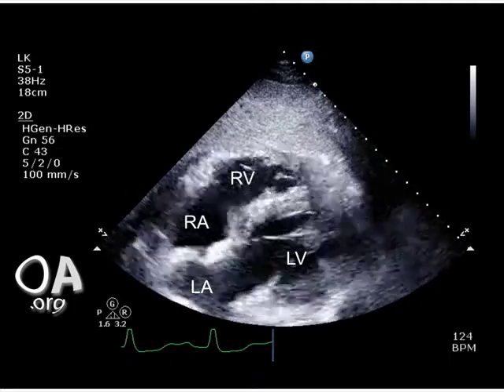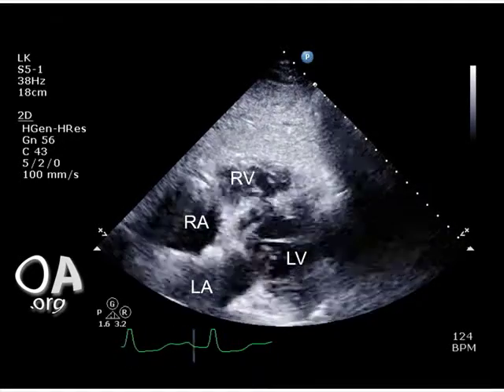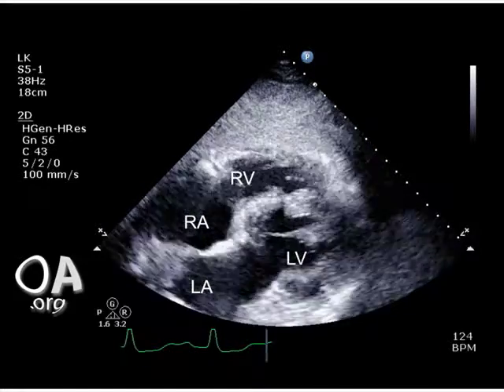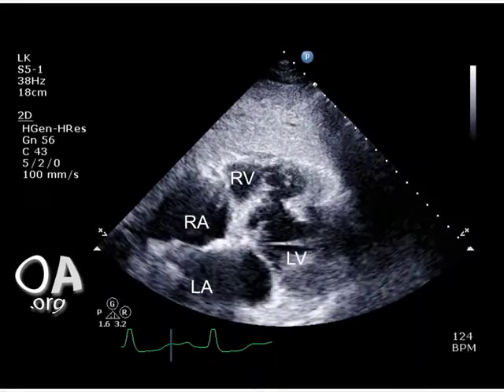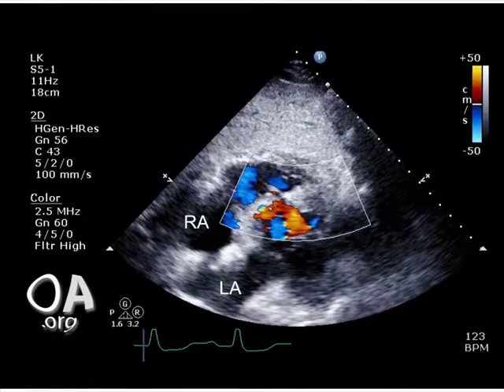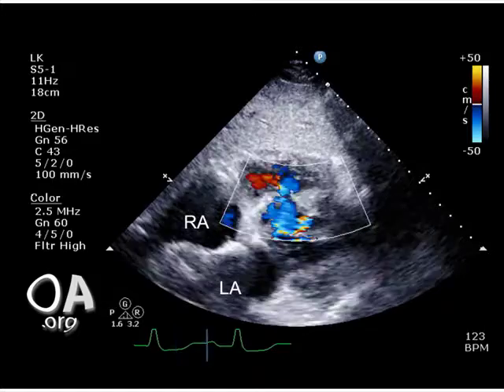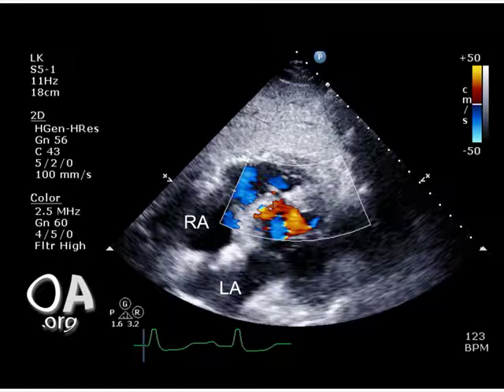This is the transthoracic echocardiogram from the outside hospital with the chambers labeled as noted. Note the large septal defect between the left and right ventricles. This is the same view as before from his transthoracic echocardiogram with color flow placed across the ventricular septal defect. Clearly there is flow noted from the left to right ventricle.